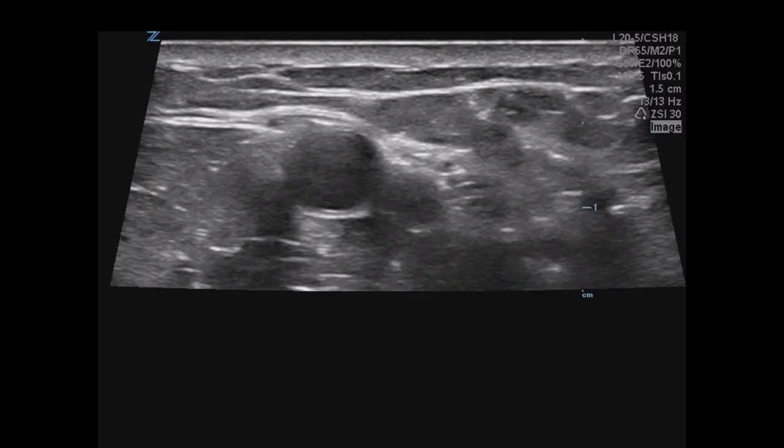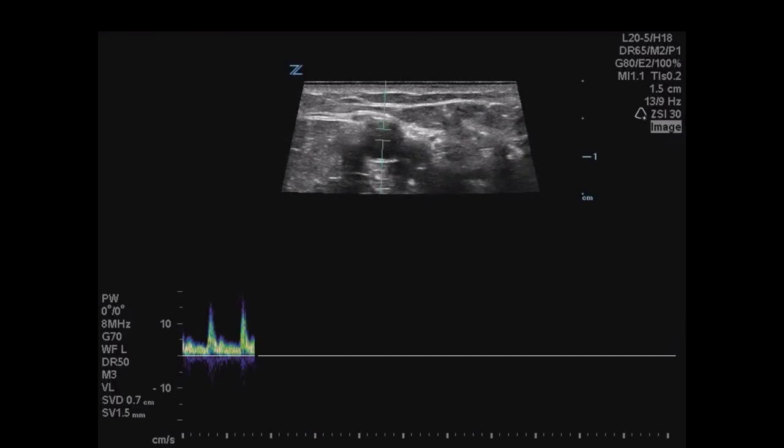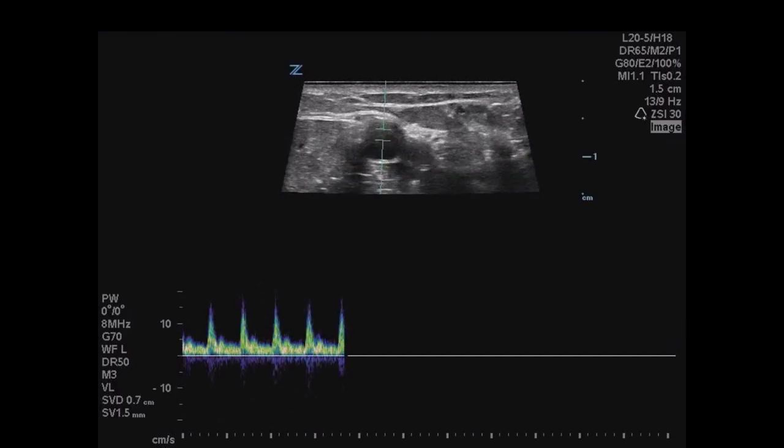If you're unsure whether a structure is an artery or vein, especially in the hypotensive patient, use spectral Doppler. This will confirm artery versus vein regardless of compressibility or blood pressure. Localize the vessel, initiate spectral Doppler on your machine, and place the gate within the vessel. We're looking for identification of artery versus vein — not necessarily systolic velocities — so we can do this in the short axis without angle correction.